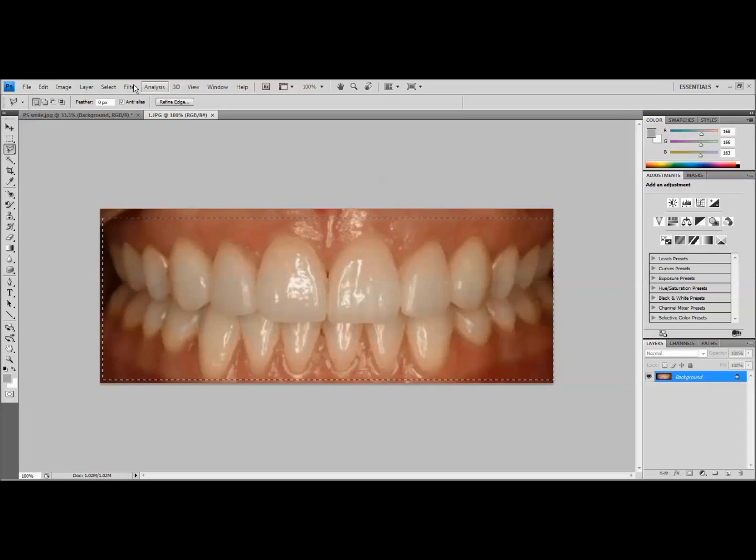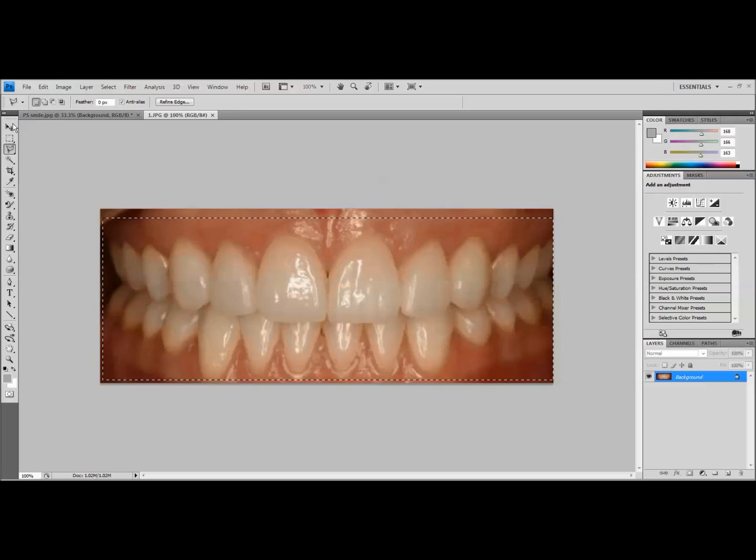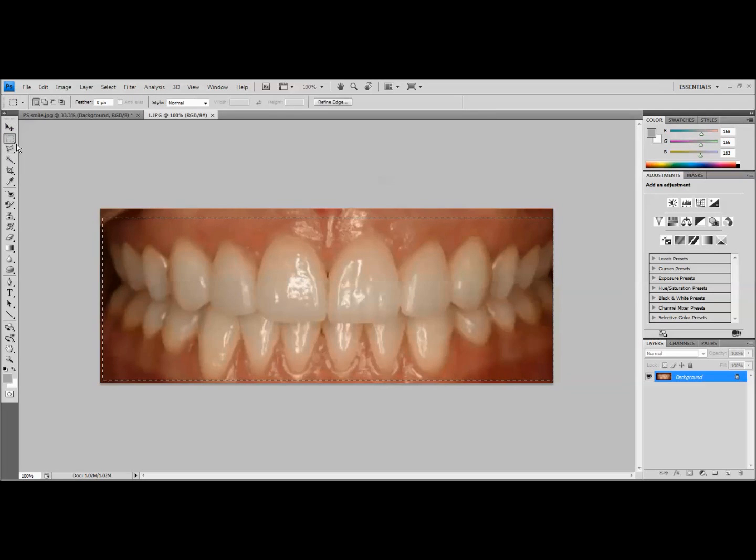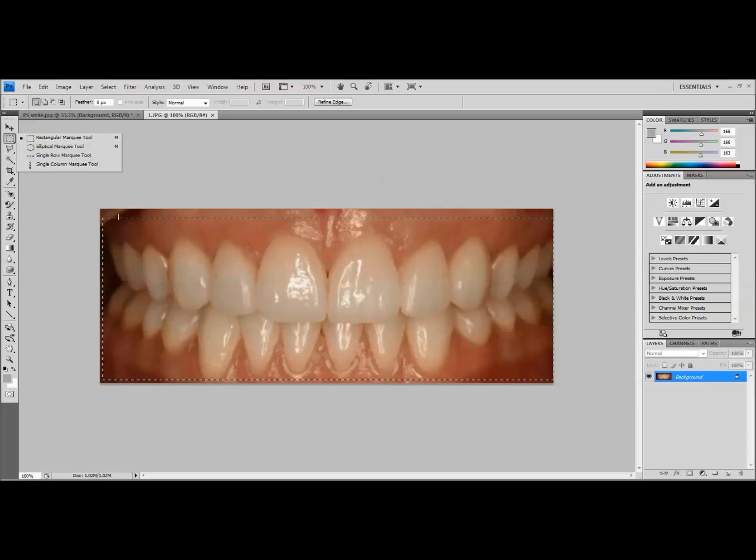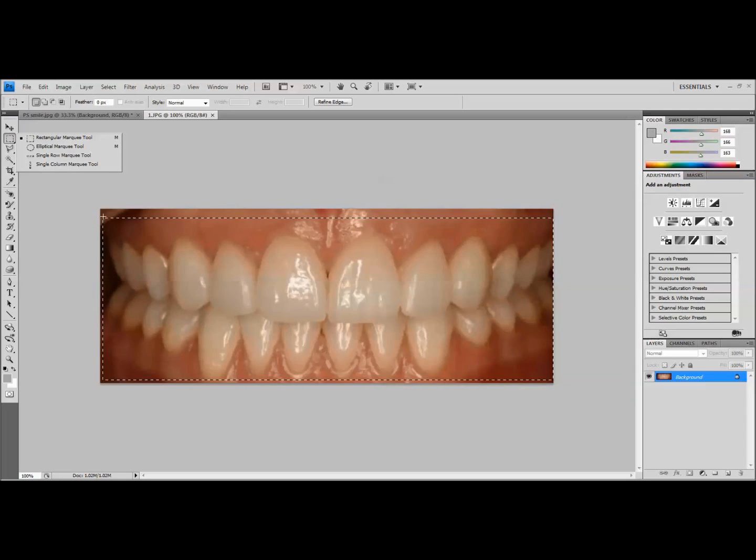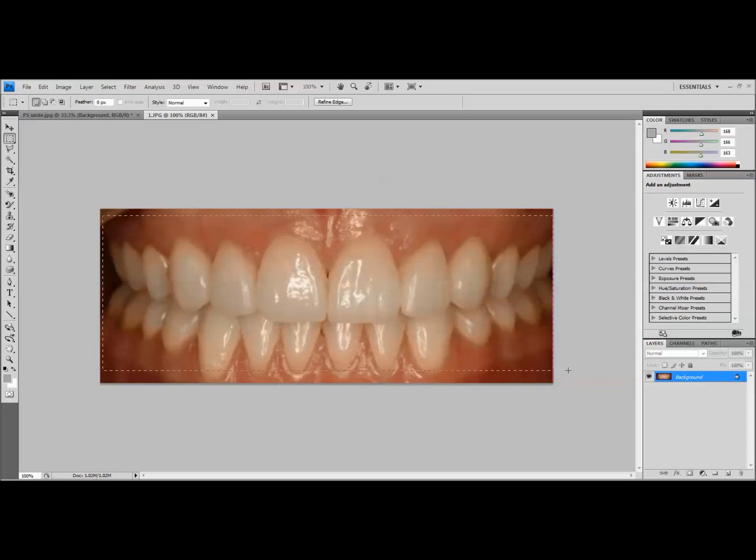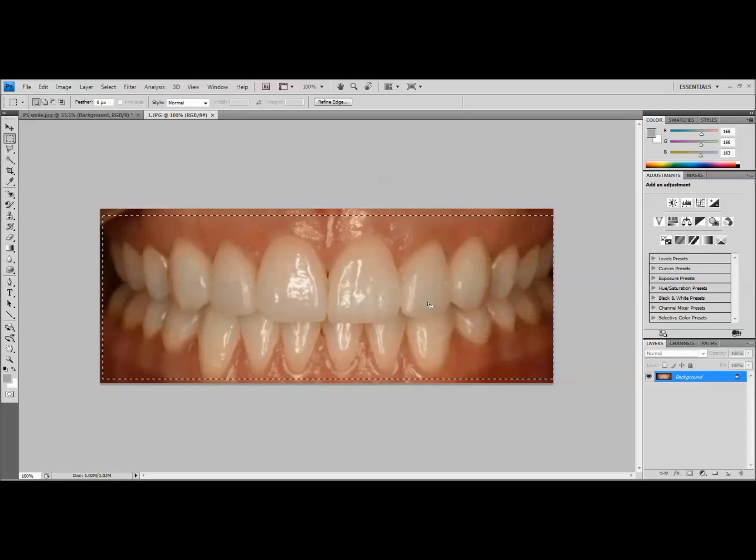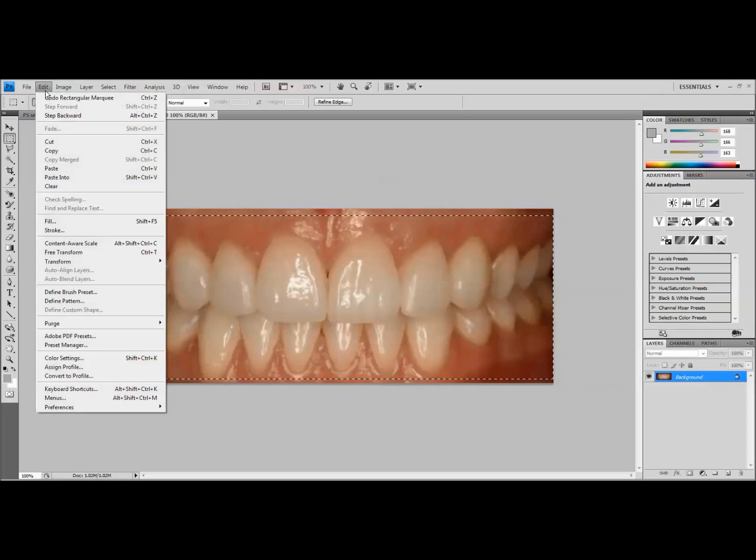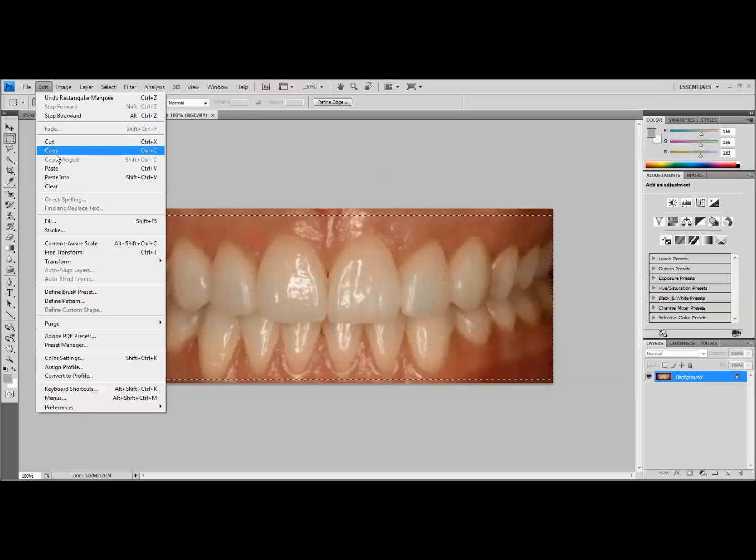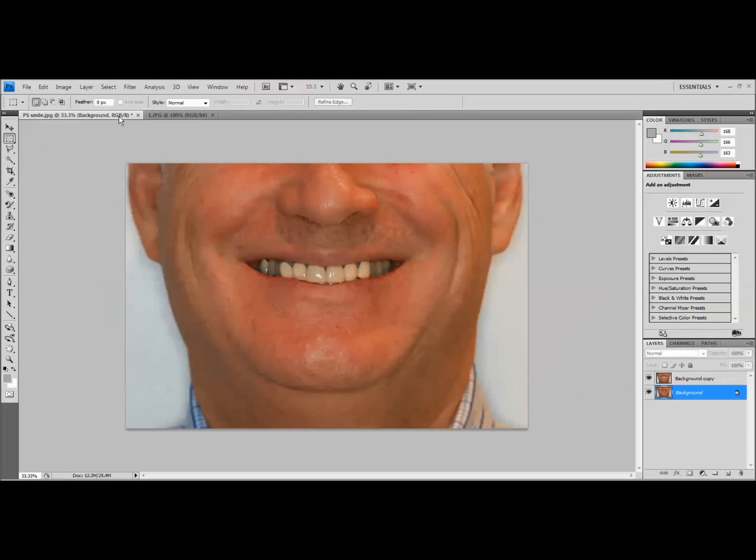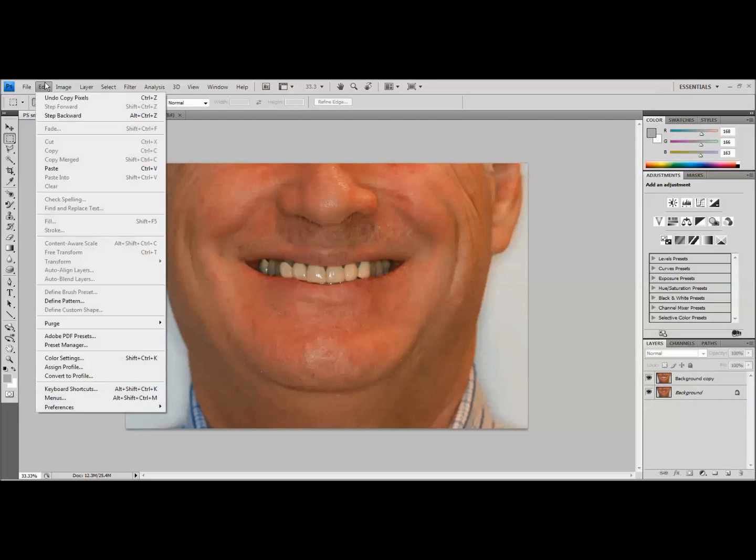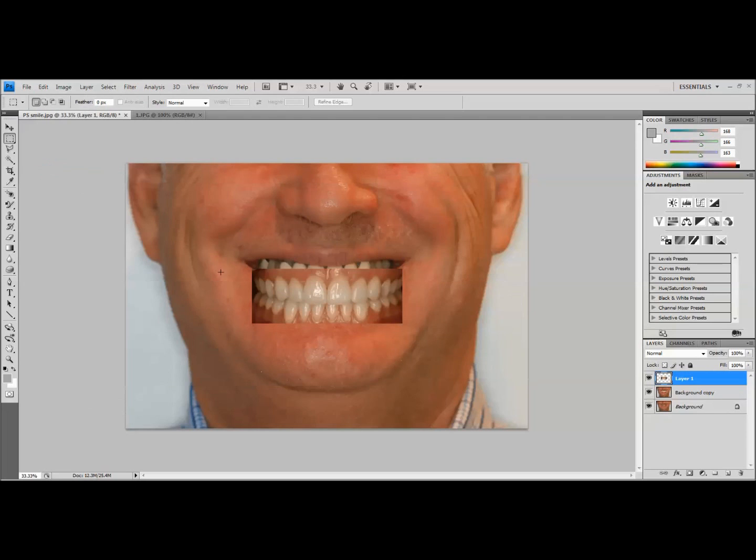So what I'm going to do here is we've highlighted this, we're going to use the rectangular marquee tool and we're going to highlight all this. And then we're going to come up here and copy it. Now we'll go back into our other one and I'm going to just click right in the middle here and I'm going to say edit and paste. And as you can see, it's created a new layer, as you can see down here on the bottom right.